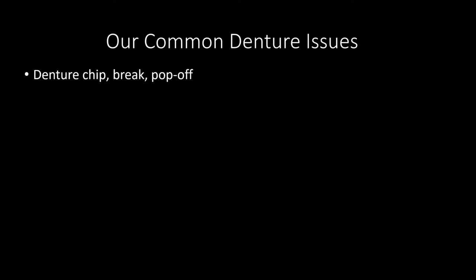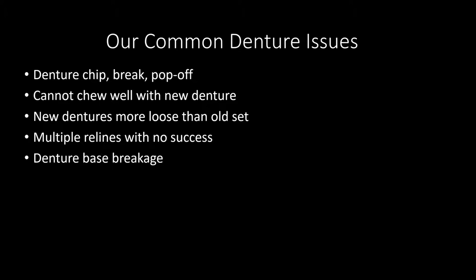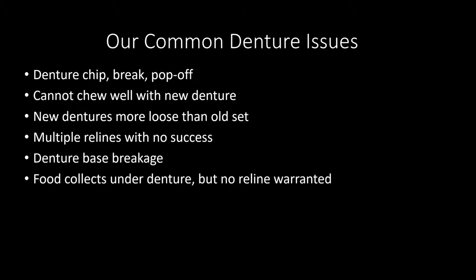And from a laboratory perspective, denture teeth chip, break, and pop off. I was really good at the beginning part of my career. Patients can't chew well with a new denture, and they're complaining. New dentures are loose, more loose than the old set. Multiple relines with no success. Of course, breakage. Food collects under the denture, but we don't need to reline it.